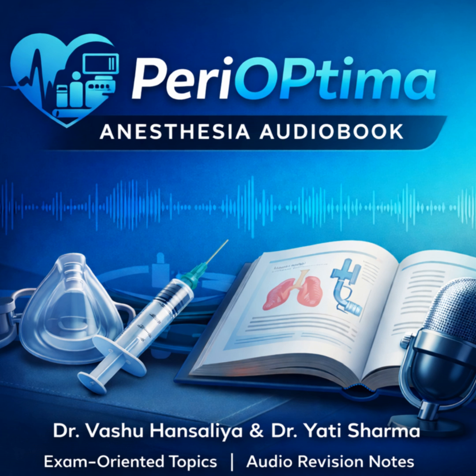In a normal brain, P1 is the tallest: P1, P2, P3. If the brain is tight, if compliance is reduced, P2 shoots up. If you see P2 higher than P1, that is a dangerous brain. That patient is running out of intracranial space. That's a great visual. P2 higher than P1 equals danger. The tidal wave is rising.